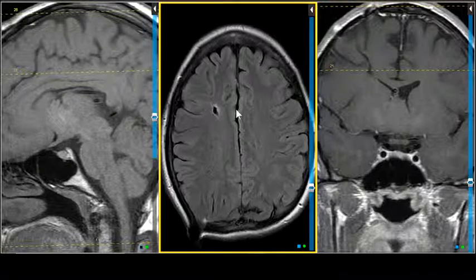Now, the thing about the midline is it's actually a great approach. It gives you great exposure, but the problem is the anterior cerebrals. So if you're thinking about something like this, where they might be thinking about a transcallosal approach, really be conscious of where the anterior cerebrals are, because that's the biggest complication of it. Because if you have an azygous anterior cerebral artery, a single anterior cerebral, they can damage it, because they can't mobilize it. Sure. So if they're looking for two of them, they're going to try to spread them or move them over out of the way so they don't damage that.